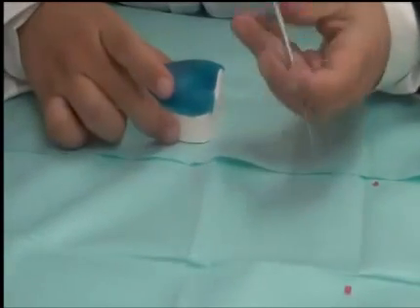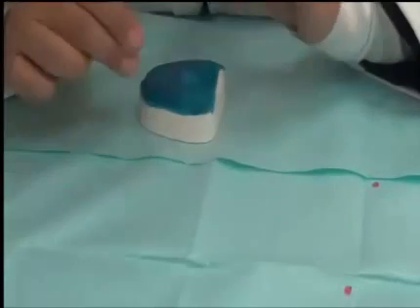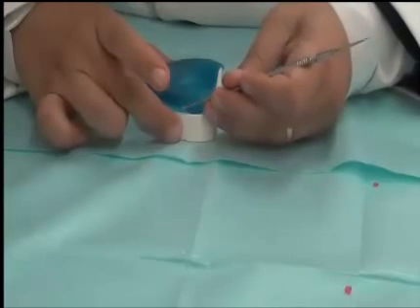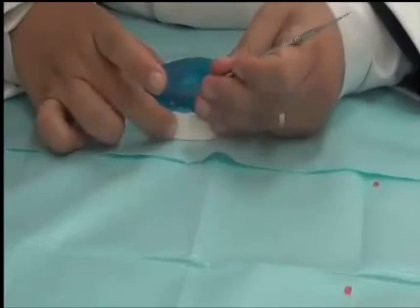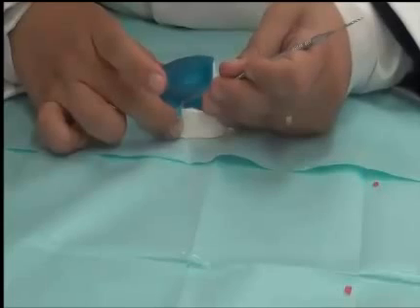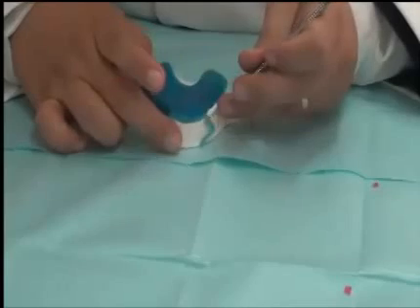And then, by the back of the instrument, or even the back of a pencil if we have, we can adapt this material from the outside to the inside of the sulcus and then smooth it. Okay? We make sure it's fully adapted, not pressing it, not thinning it. We're just doing the adaptation step. So we keep the thickness of the material uniform.